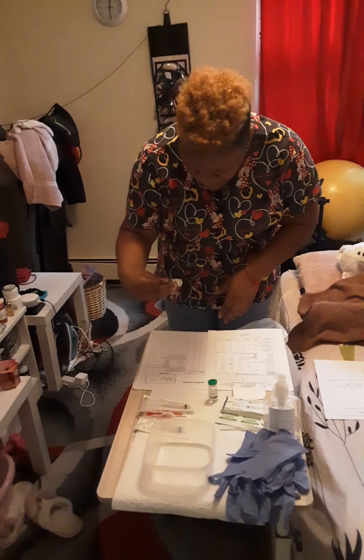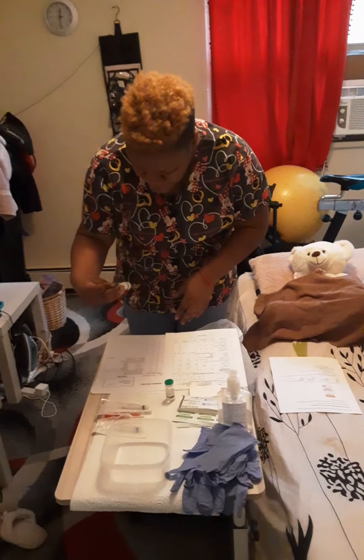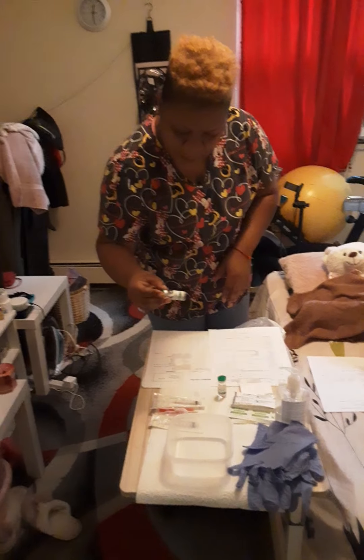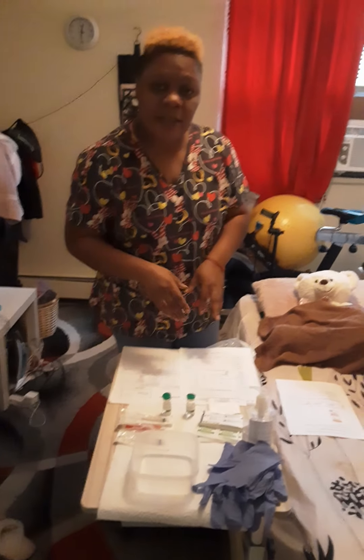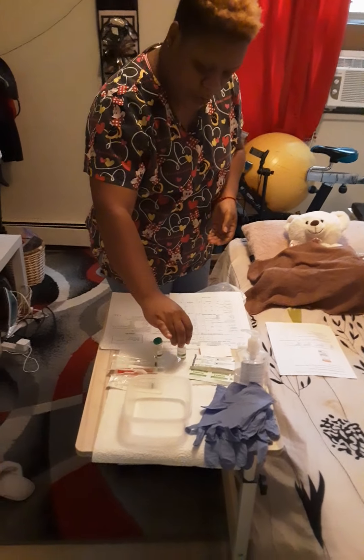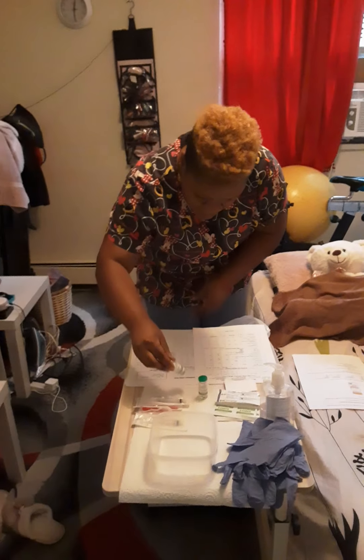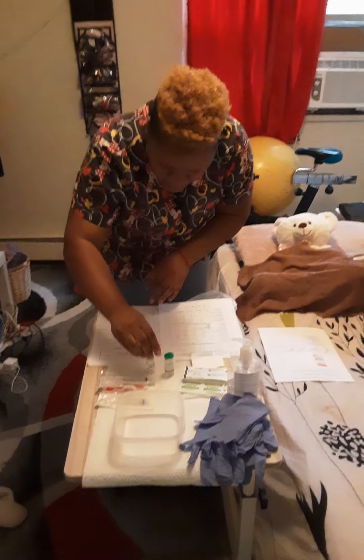I'm going to check the name of the patient, the name of the medication, the dosage, and the route. With that medication as well I will check for the expiry date. It's 2025 so it is good to administer. The medication needs a diluent to be added to mix together. I am going to check the expiry date on that diluent as well. I'm going to double check everything, the medication with the MAR.